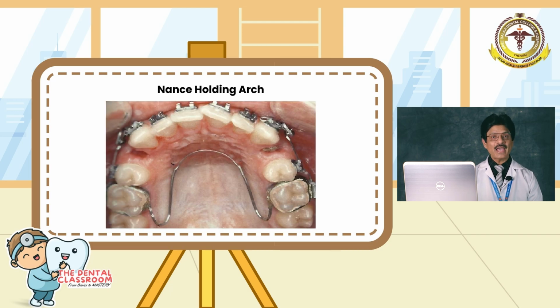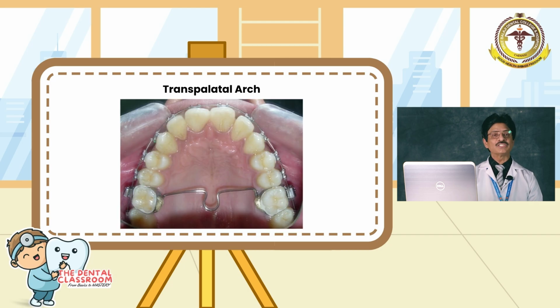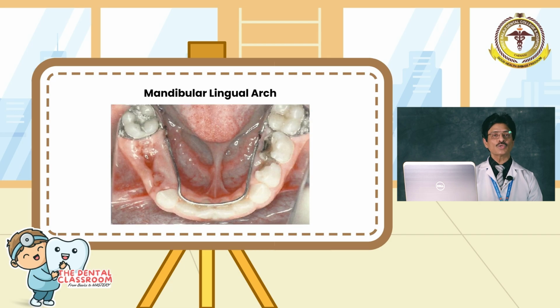We can also use anchorage intraorally, known as the Nance holding arch, and if an acrylic plate is placed in the front, then it adds more to the anchorage. We have the transpalatal arch, which is a sort of an omega loop between the 2 molars, and in the case of the mandible, we can use the mandibular lingual arch.